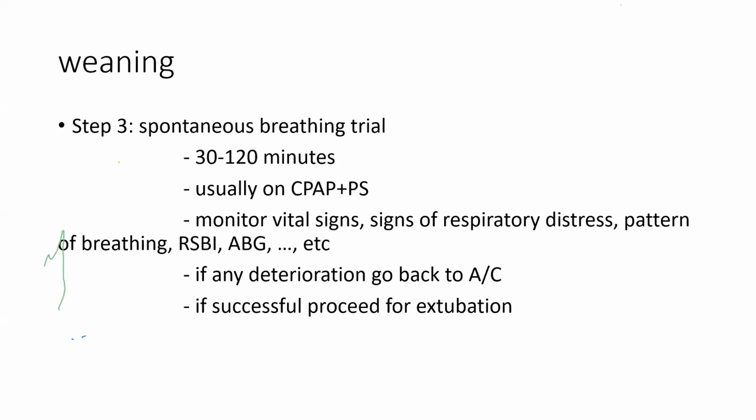During this period, the patient is breathing spontaneously, but still on mechanical ventilation and supported by mechanical ventilation. This mode allows you to keep the endotracheal tube in and to monitor the patient well: monitor the volume he's taking, monitor him clinically, monitor his ABG, monitor his rate. And if all signs point towards the patient being able to breathe adequately on his own, then this is the time to take out the endotracheal tube and free the patient totally from mechanical ventilation.